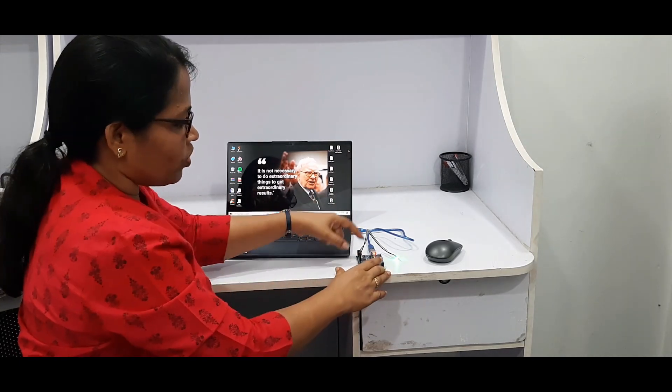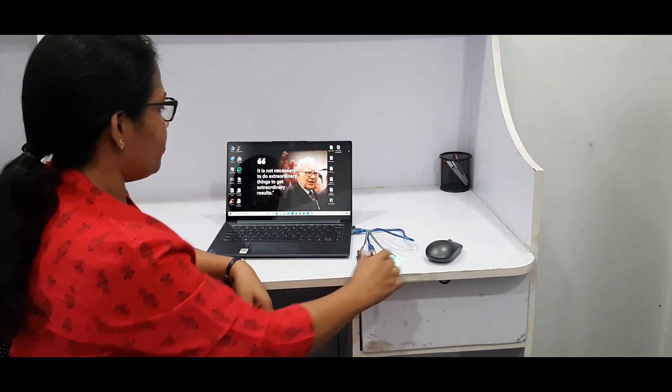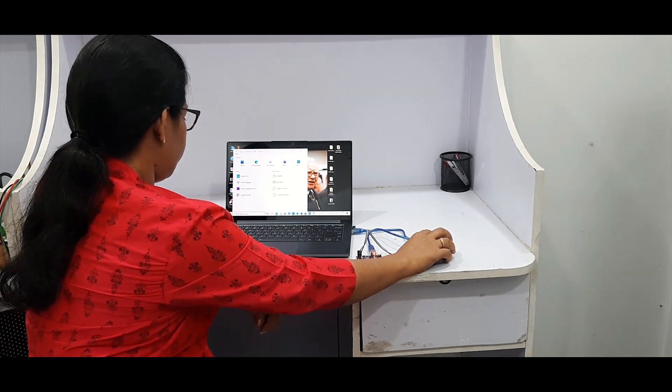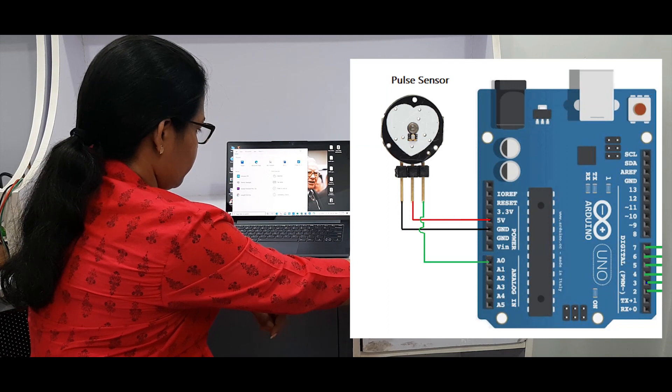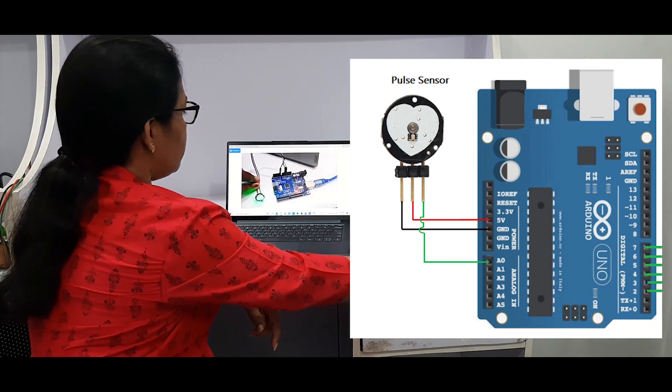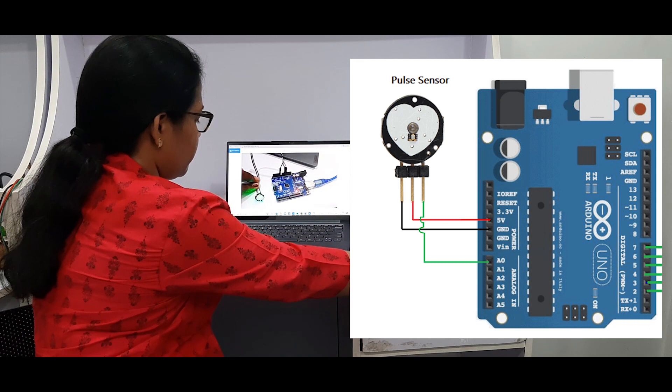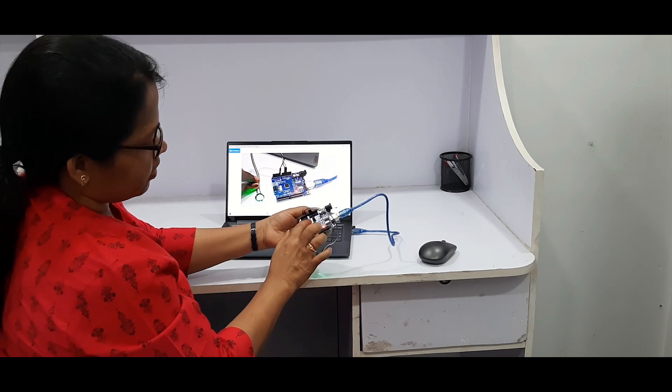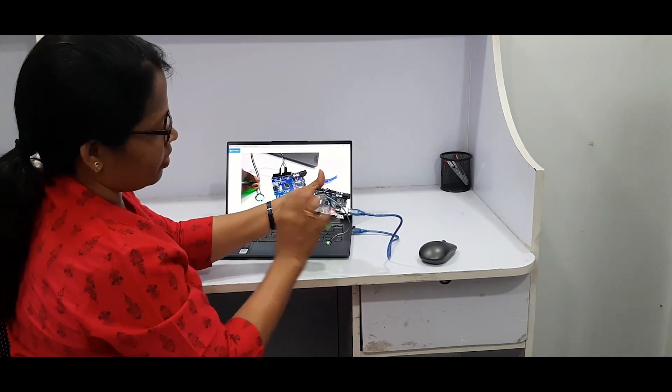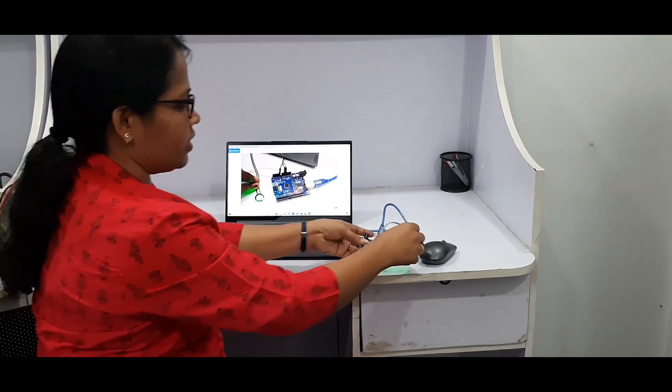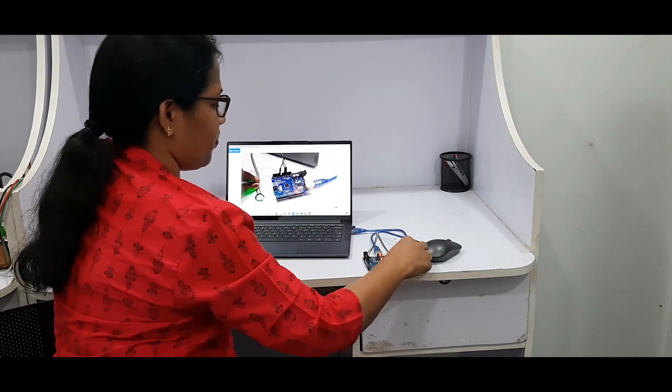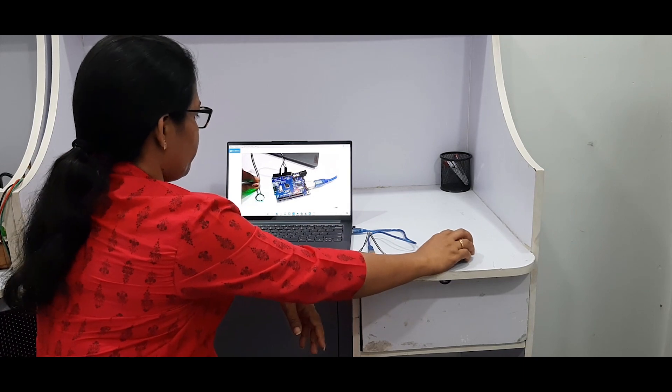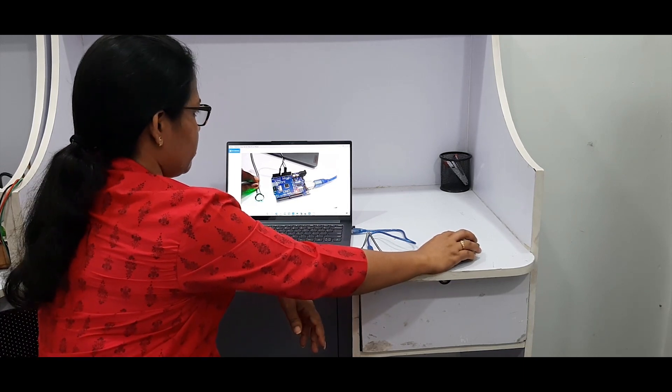The board is powered from the USB cable itself. So this is how you have to make the connection - 5 volt, ground, and 1 analog output. After connection, you go to the Arduino software.